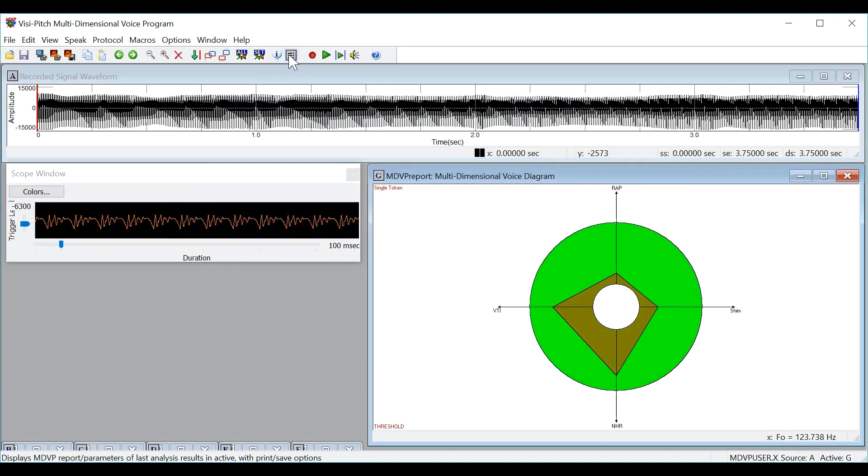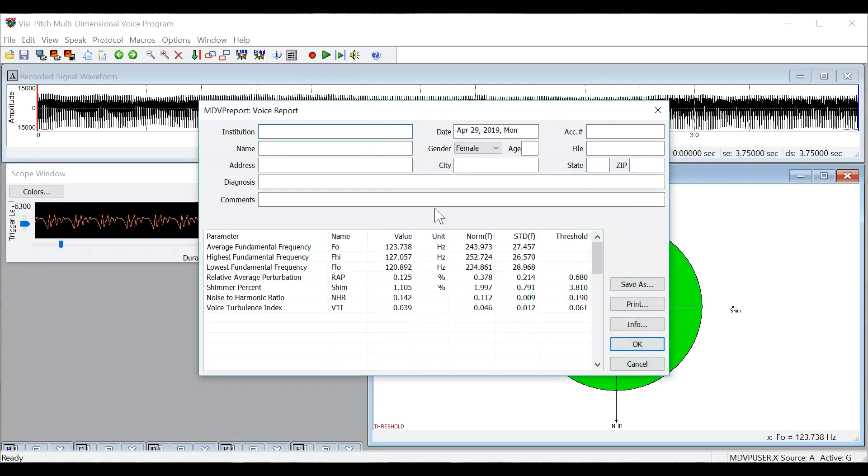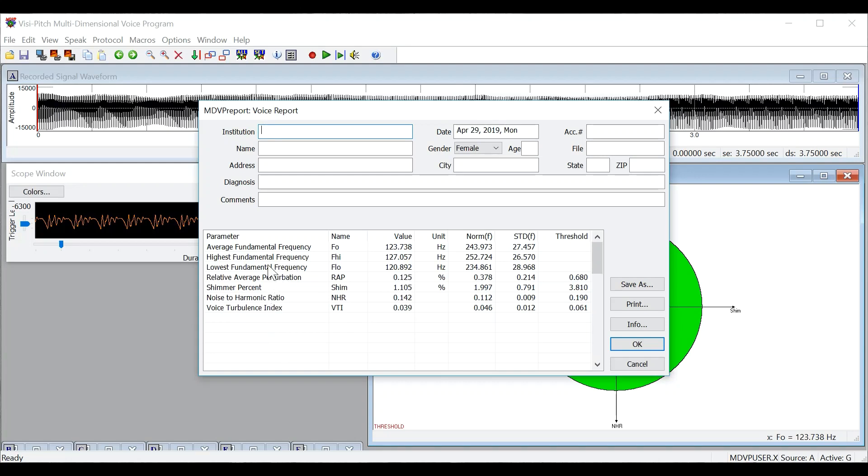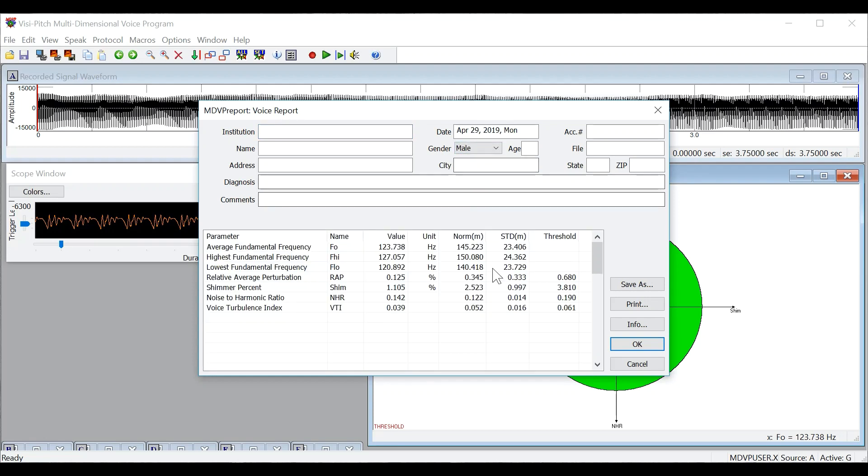You can then go to the MDVP report parameters menu, and here you will see the report for all of the parameters in the MDVP analysis, as well as some other parameters. It is important to change the gender for the user to get the correct normative data in the report. You can then save this or print it for later use.